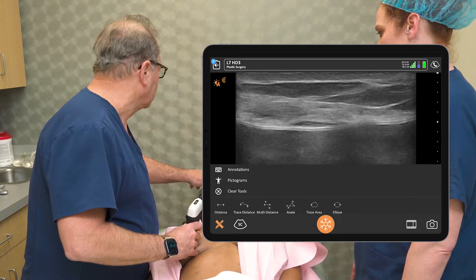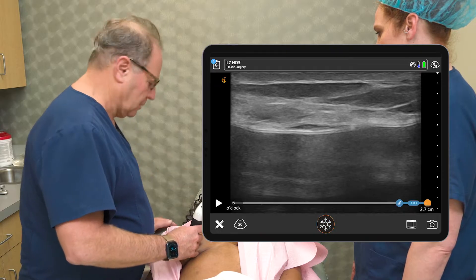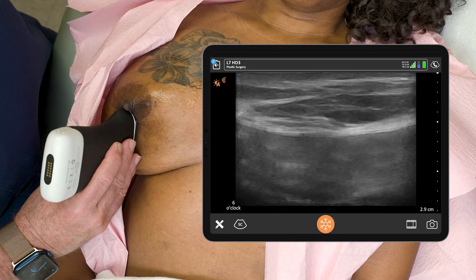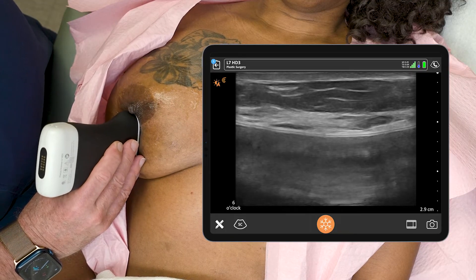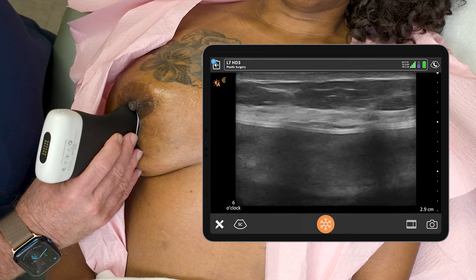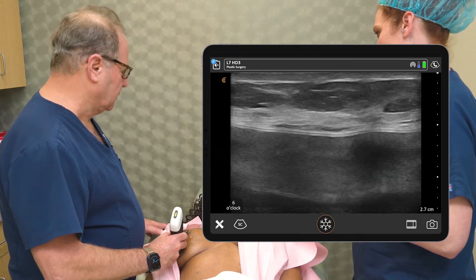I'm going to go to 6 o'clock and start there. Just wipe the gel around. My button on the scanner is what stops and starts, and here it looks okay — that looks more normal. Sometimes we'll see this reverberation artifact where it looks like there are multiple shells, but that doesn't mean it's broken. We'll take one image there. We freeze it with one button, and then the top button saves the image.